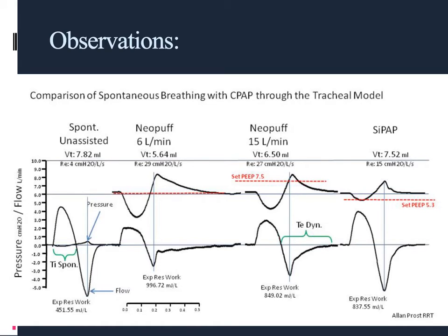So this is a rather complex diagram, and what we do is, right now, the ASL is spontaneously breathing through that tracheal model, which is that 5.0 endotracheal tube. So this first breath that we're looking at here is just the ASL5000 breathing through that 5.0 endotracheal tube. So with our initial settings, work of breathing established on the ASL5000 and our 5.0 endotracheal tube, if we zoom in really carefully here, you can see that there's very little spontaneous work of breathing.